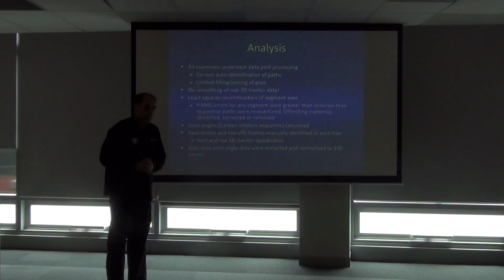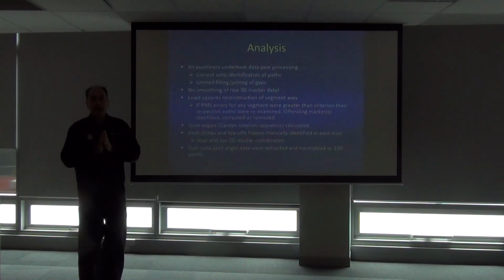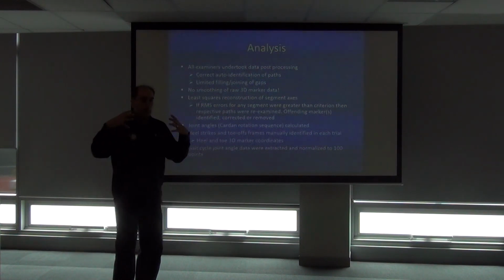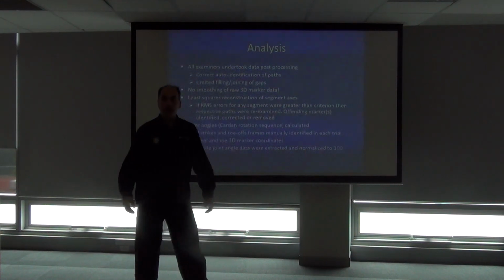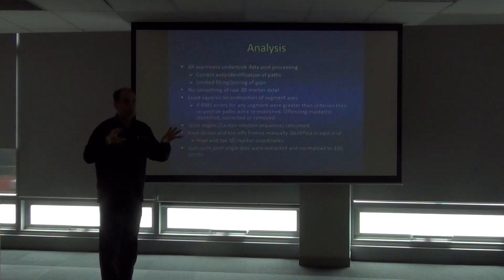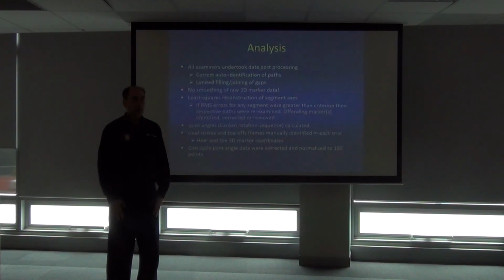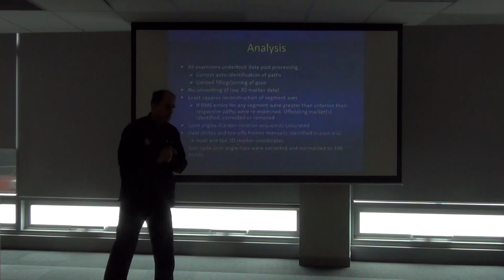What I compare that with are criterion values for the RMS error for each segment. For a perfectly identified, tracked, labelled trial, we know what the mean and the maximum, so mean plus 3 standard deviations, of the RMS error should be, for each segment. It's different for each segment, depending on the amount of skin movement artifact and other things going on.